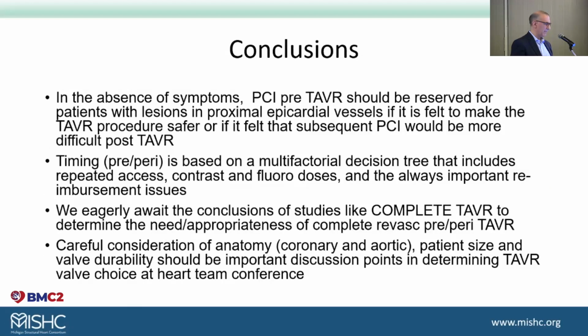So in conclusion, in the absence of symptoms, pre-TAVR PCI should be really reserved for patients with lesions in a proximal epicardial vessel, if it's felt to make the TAVR procedure safer, or if it's felt that subsequent PCI would be more difficult post-TAVR. Timing of PCI is based on a multifactorial decision tree that includes repeated access, contrast and fluoro dose, and the importance of reimbursement issues. We eagerly await the conclusion of studies like COMPLETE TAVR, and careful consideration of coronary anatomy, patient size, and valve durability should be important discussion points in determining TAVR valve choice at Heart Team Conference. Thank you.